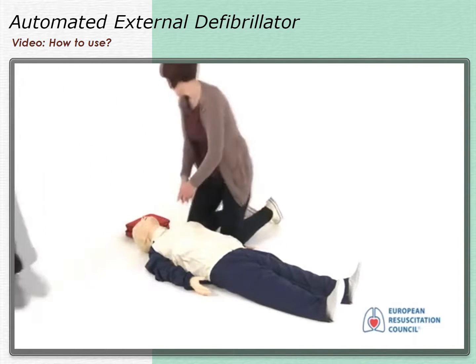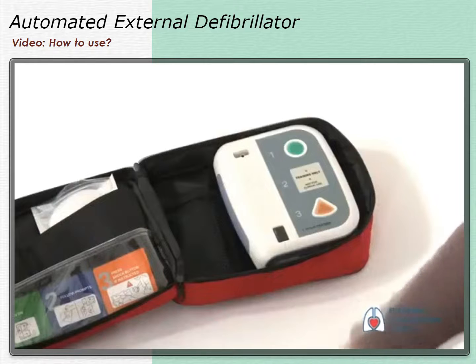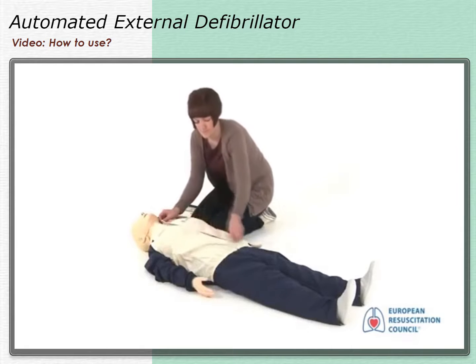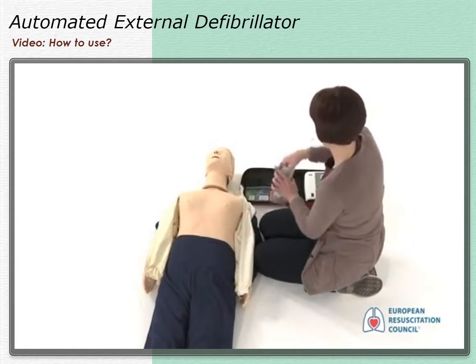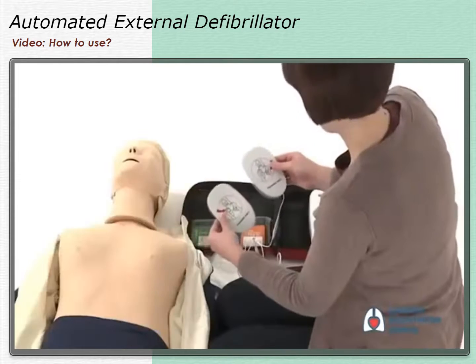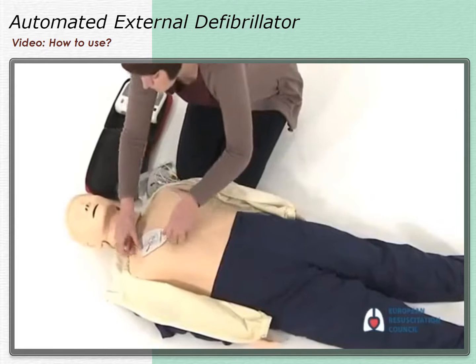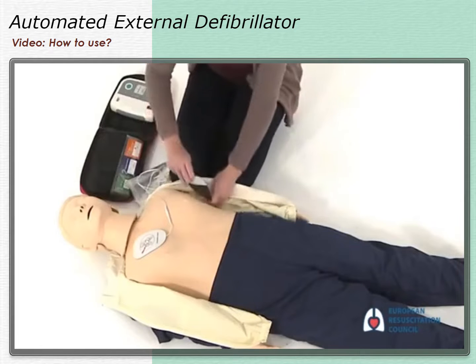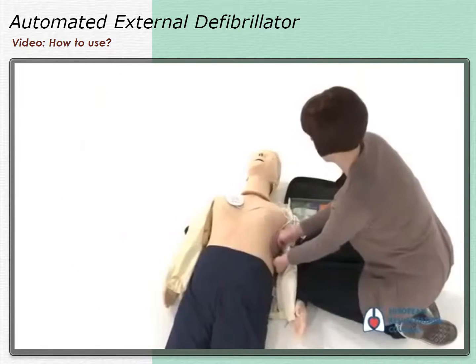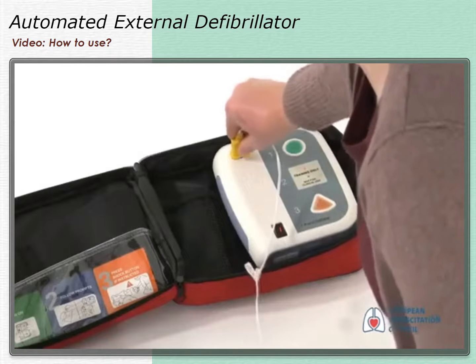When the AED arrives, immediately switch it on and follow the voice prompts. Apply pads to the patient's bare chest. Remove the victim's clothes to expose their bare chest. Remove the pads from the package, looking carefully at the pictures shown on each pad. Peel off the first pad and place it exactly as shown in the picture on the pad. Peel off the second pad and place it exactly as shown in the picture on the pad. Plug in the pad's connector next to the flashing light. If needed, connect the pad's connector to the AED.